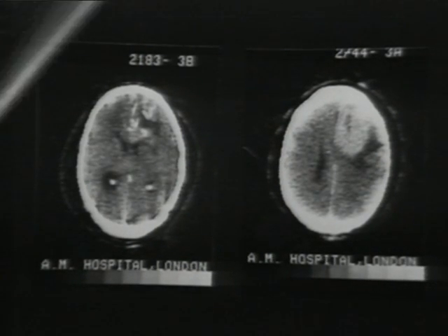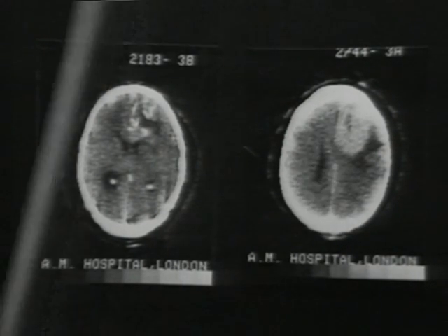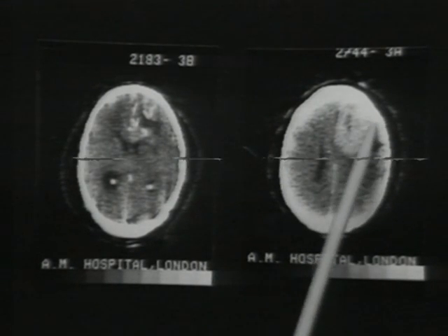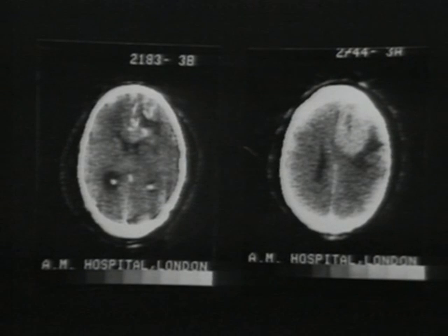Now, the next patient is a quite different problem. This is a patient with a benign tumor. This is a meningioma and shows up because of the calcification in the psammoma bodies. Behind the tumor, you can see a roughly crescentic area of darker brain, which is edematous.